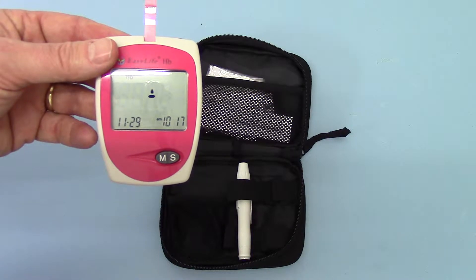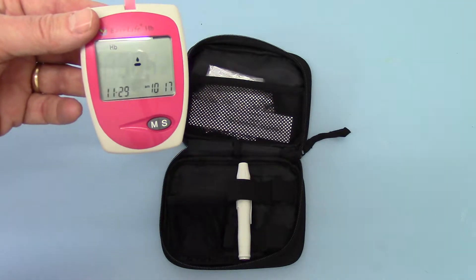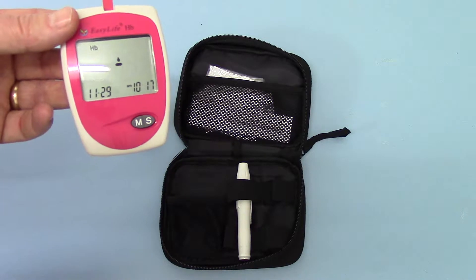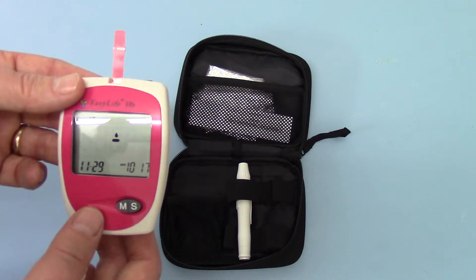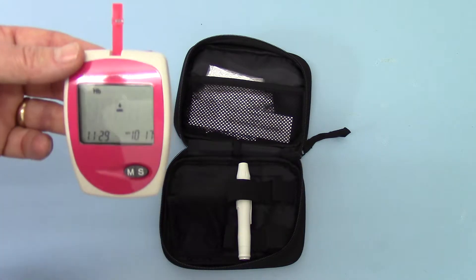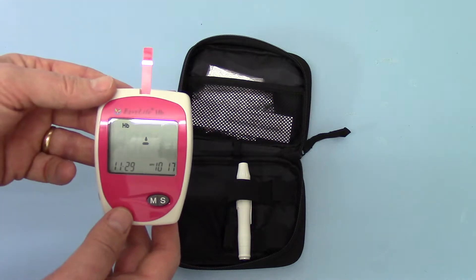The millimole reading is correspondingly lower than the grams per decilitre equivalent. It might be 7.6 in millimoles per litre and 13 or 14 equivalent in grams per decilitre. So you just need to check that when you do your first test, the display is giving you grams per decilitre — the UK reference levels.